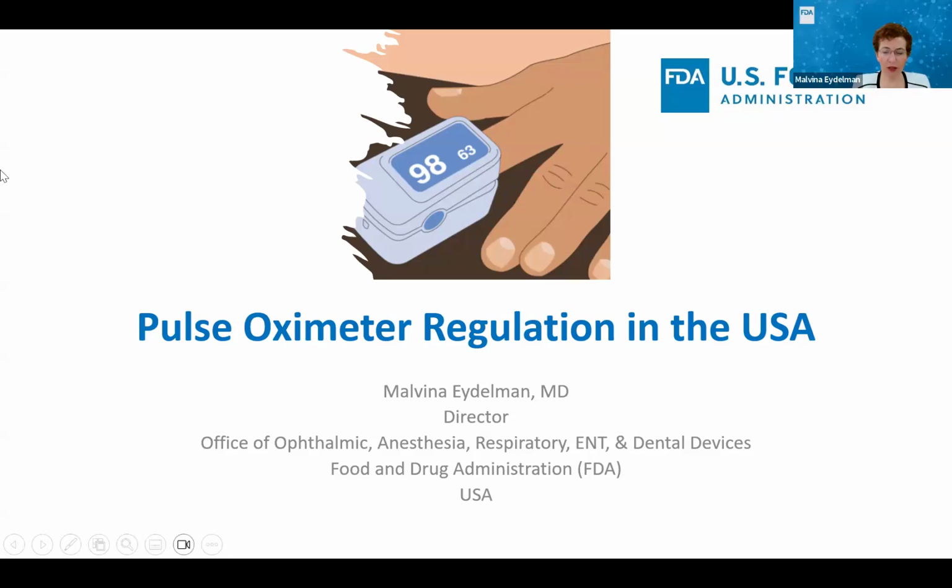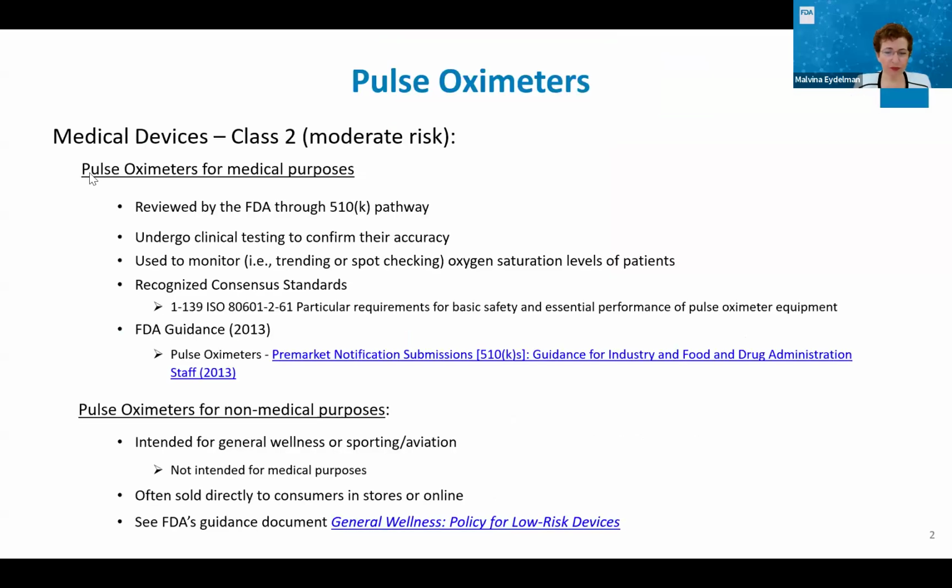Thank you very much for inviting me, and kudos for organizing this incredibly important meeting. In the United States, pulse oximeters are considered medical devices. Pulse oximeters intended for medical purposes, regardless of whether the device is offered as a prescription or over-the-counter device, must undergo FDA's pre-market review and receive something we call 510(k) clearance prior to marketing. So pulse oximeters in the United States undergo clinical testing, bench testing, and other standardized tests to review the device's relative safety and effectiveness as compared to the predicate devices on the market.